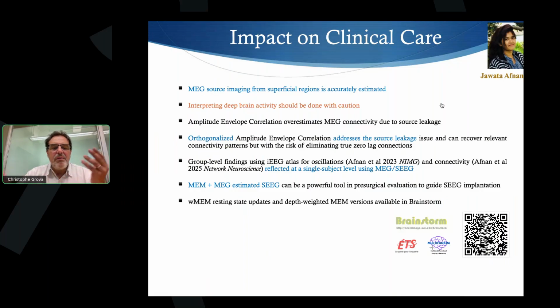I did not go into those details, but if you have the chance to have access to a MEG or to more high density EEG, it's probably better and more accurate. But we are showing more and more that if you have a lot of trials, like long recording with low density EEG, you could still do a decent job, not perhaps as accurate, but quite informative, and we have some projects going on at that level as well. So that it can be broadly used by many epilepsy centers, even if you don't have access to a MEG, for instance. Got it.